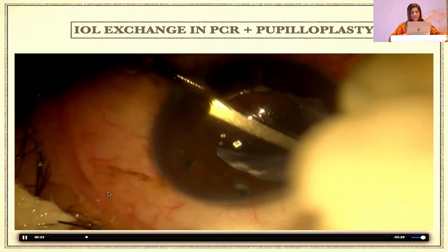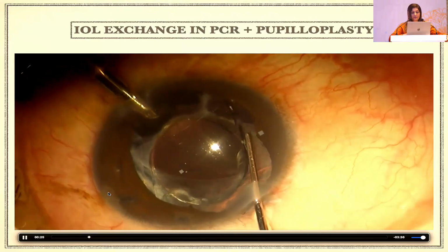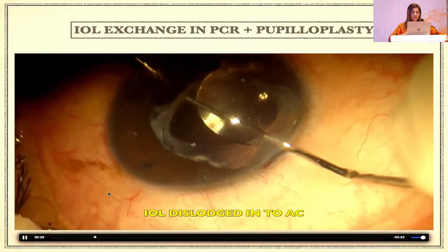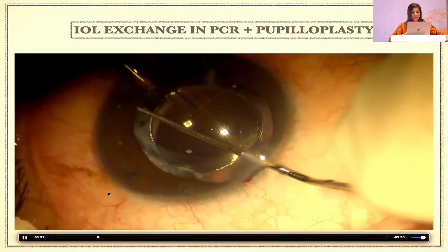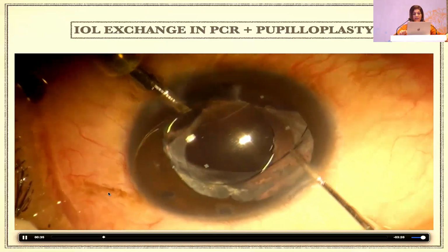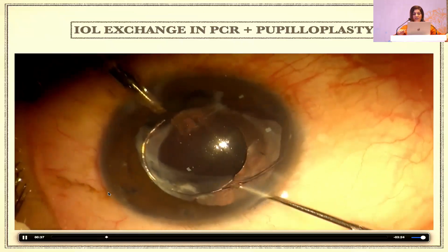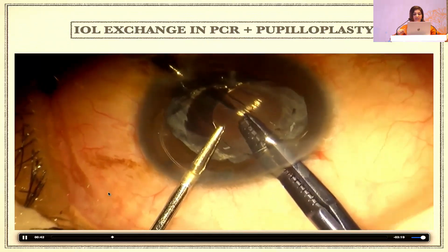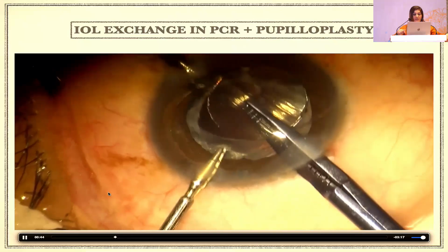So what I'm actually trying to do here is remove all the adhesions which are there around. And I had decided that maybe I will cut this intraocular lens. So I take up the IOL cutting forceps, but then I eventually realized that this intraocular lens is a PMMA IOL, and there is no way I can cut it with any of the forceps that I would actually have.